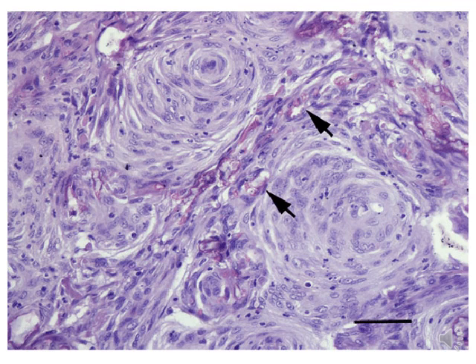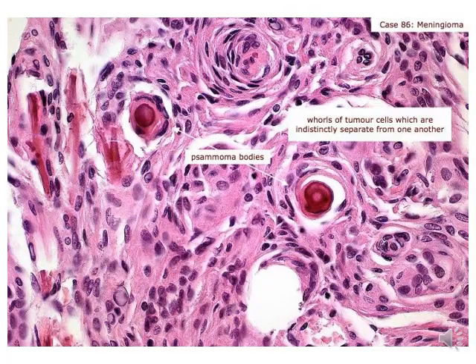Another picture for microscopic findings of meningioma formed of meningeal cells with whorly appearance or whorl pattern. Another microscopic picture of meningioma showing the whorly pattern or whorly arranged meningeal cells.